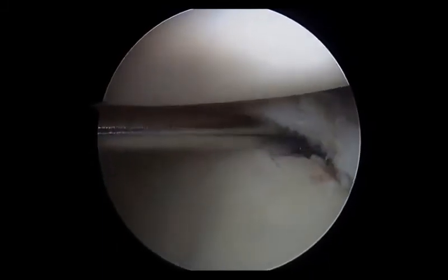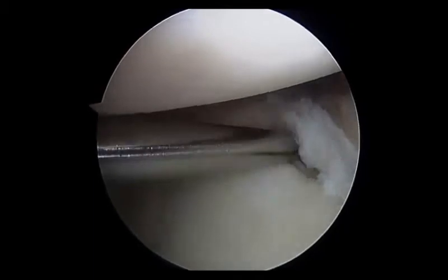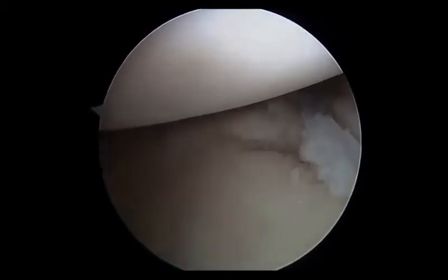Having already identified a posterior labral tear, a periosteal elevator is used to liberate the labrum off the glenoid rim. It is critical to have adequate mobilization of the labrum and tissue.